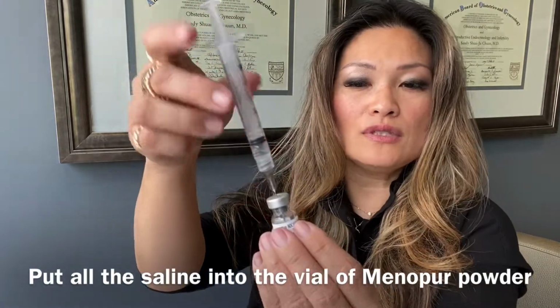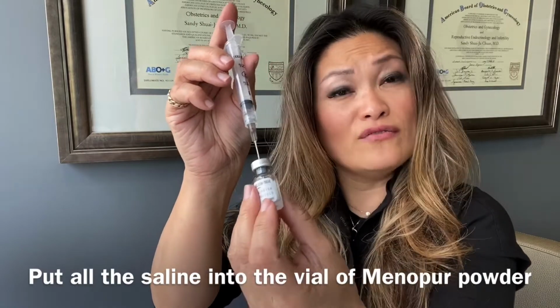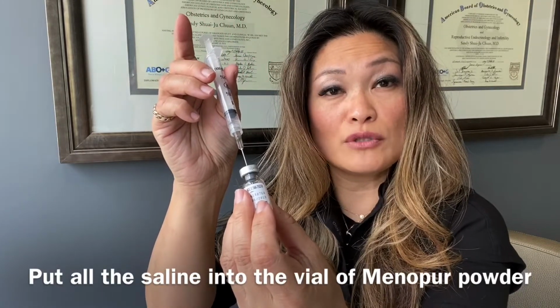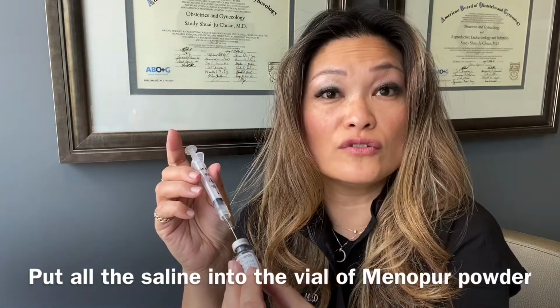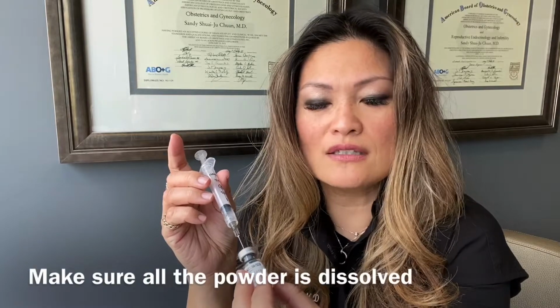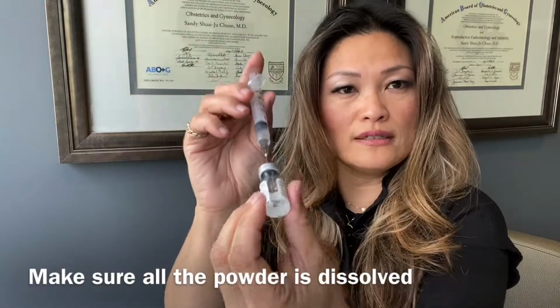One little thing that I always tell people is there's a little bit of vacuum suction in these bottles. So even when you just put the needle in, sometimes it'll suck out a drop or two of fluid, and that may be enough to dissolve your powder. And so it seems like, oh my gosh, was there powder in there or not? Is it empty? It's probably just because the few drops had already dissolved it. So basically you have it like this.